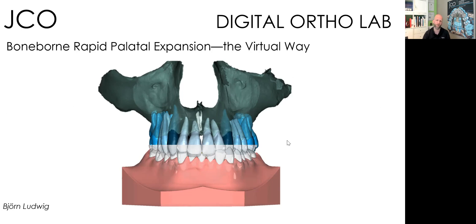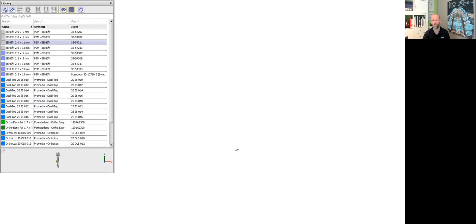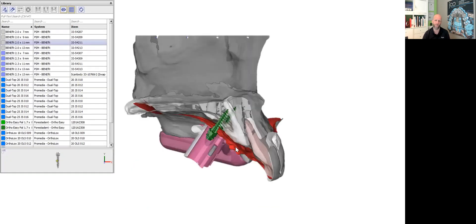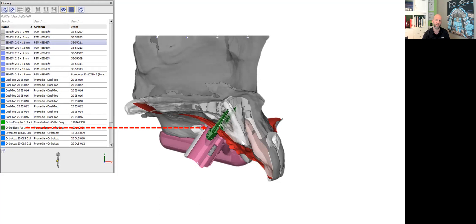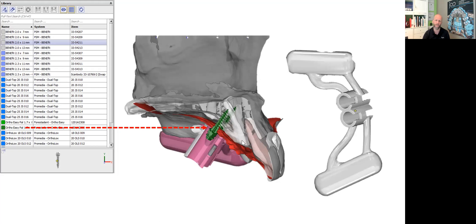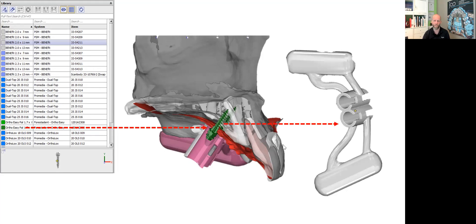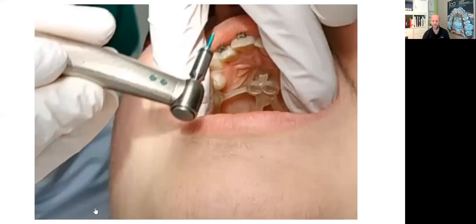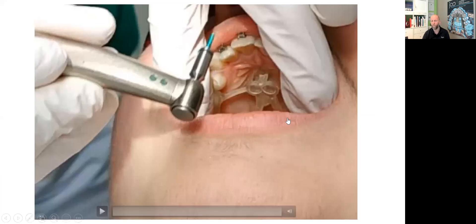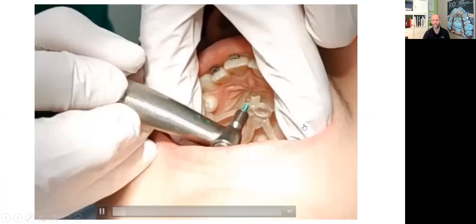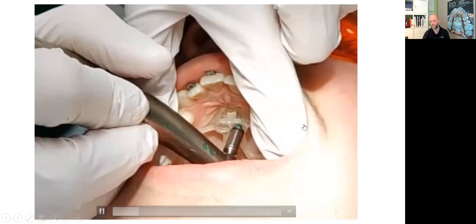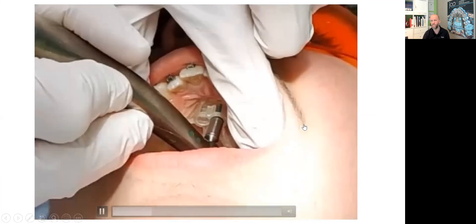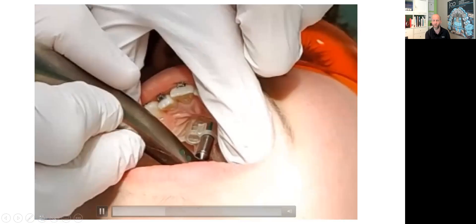In another part of this component, we will show you in detail how to digitally place tags by selecting a screw out of the library and insert it digitally in the computer. This procedure is followed by an automatic process designing an insertion guide, which is quite helpful in precisely placing a mini-screw at the palate chairside, as you can see in this short sequence.